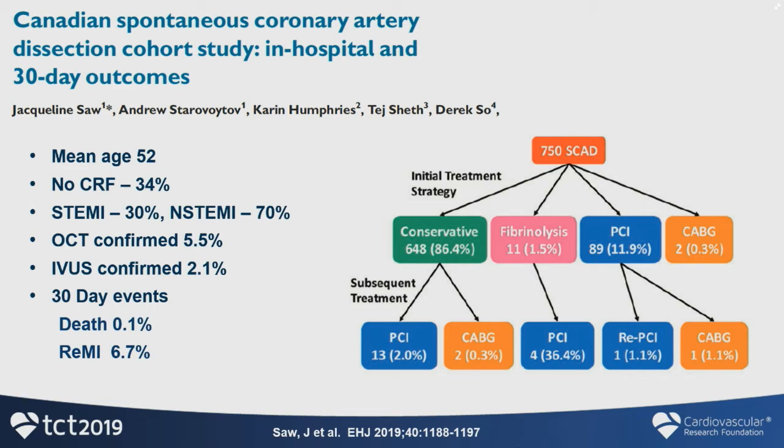Intravascular imaging is actually used relatively uncommonly in the diagnosis of SCAD because usually you can pick it up on the angiogram, and it's better to avoid instrumenting the artery wherever feasible. And it was performed uncommonly in this registry as well. And you can see on the right the initial management of these patients. It is appropriate to manage SCAD without a stent in the vast majority.